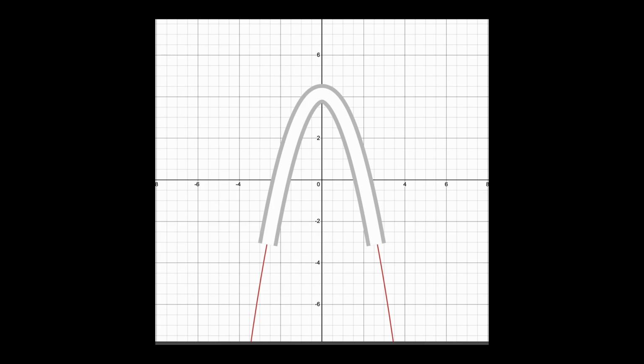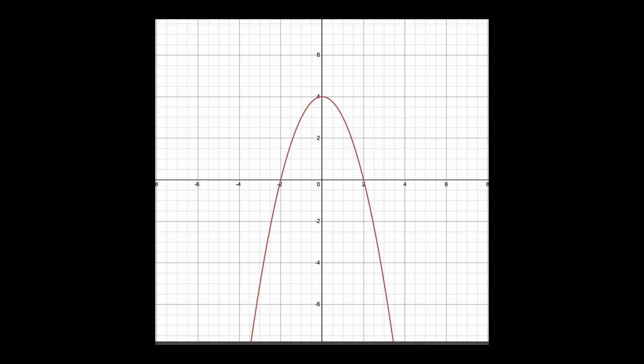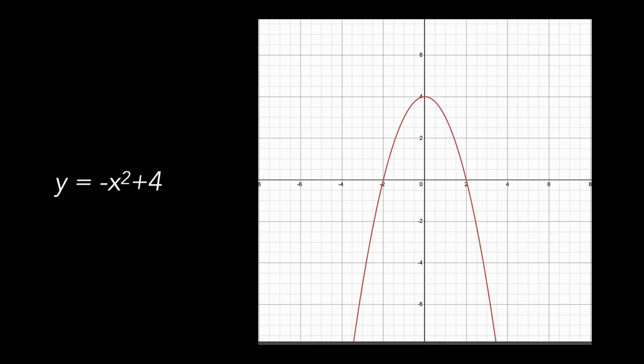And with that oversimplified parabolic structure, we can then turn that into a mathematical equation. And so in this situation, I'm just assuming a real simple parabolic expression here, y equals minus x squared plus 4. And so essentially what we're doing, and for those of you who don't love math, I know you're kind of glazing over. I'm like, oh boy, this is going to be a long lecture. This is going to be rough.